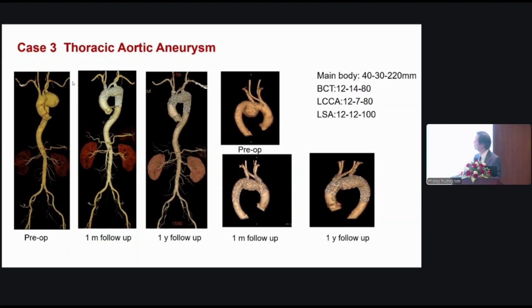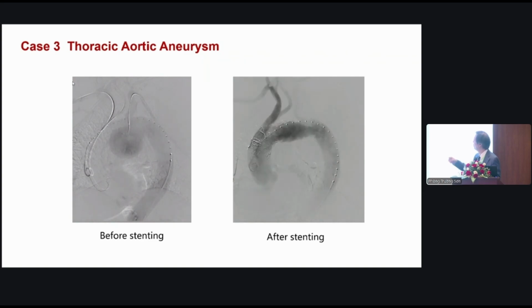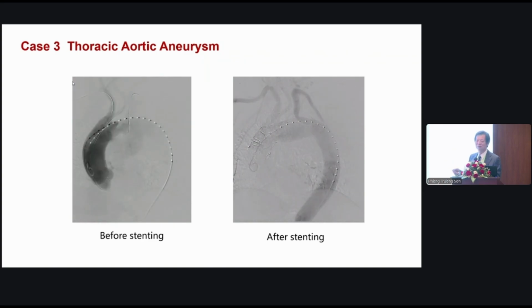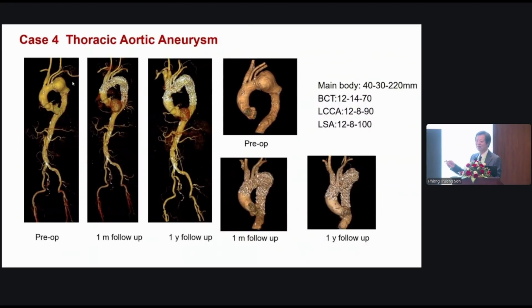So that's our angiogram. Then we deploy all the stent graft, then perform the angiogram, no endoleak. So that's a very challenging case. That case, I have done it in 109 minutes.